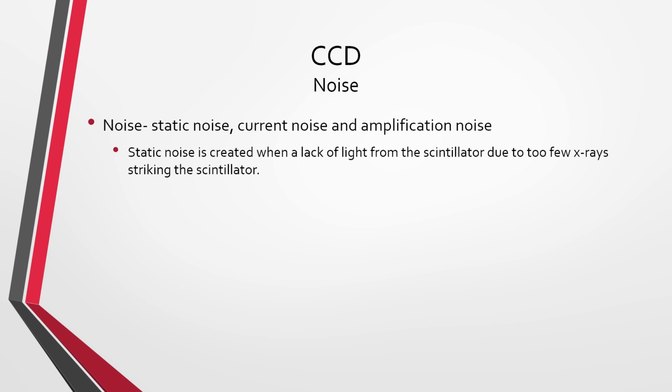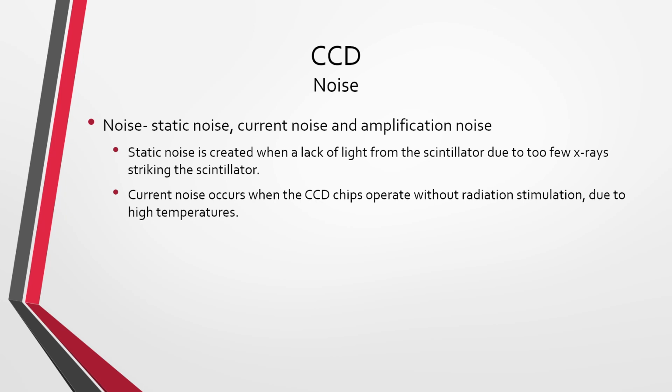Maybe they have prostheses, and all that metal is absorbing a lot of the X-rays in that area, so the CCD will have a hard time with that low light situation, a low signal really. Current noise occurs when the CCD chip operates without radiation stimulation due to high temperatures. If the detector gets hot, CCD chips are much more sensitive to this kind of thing.